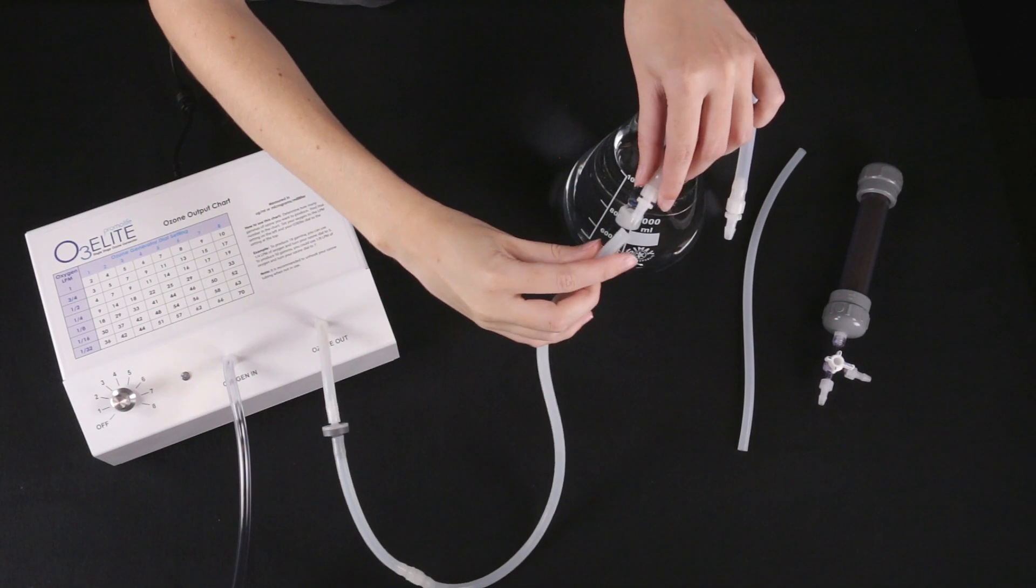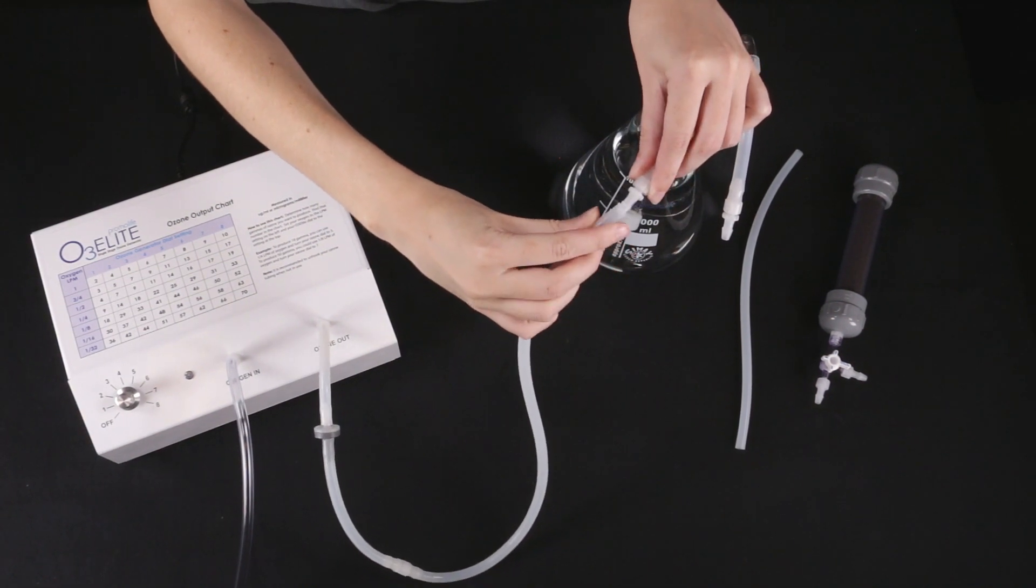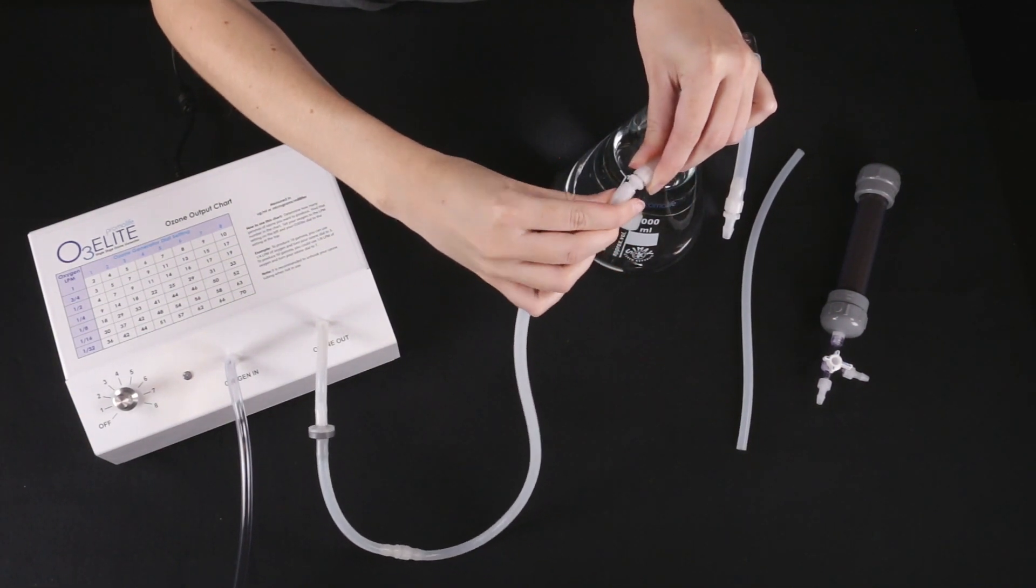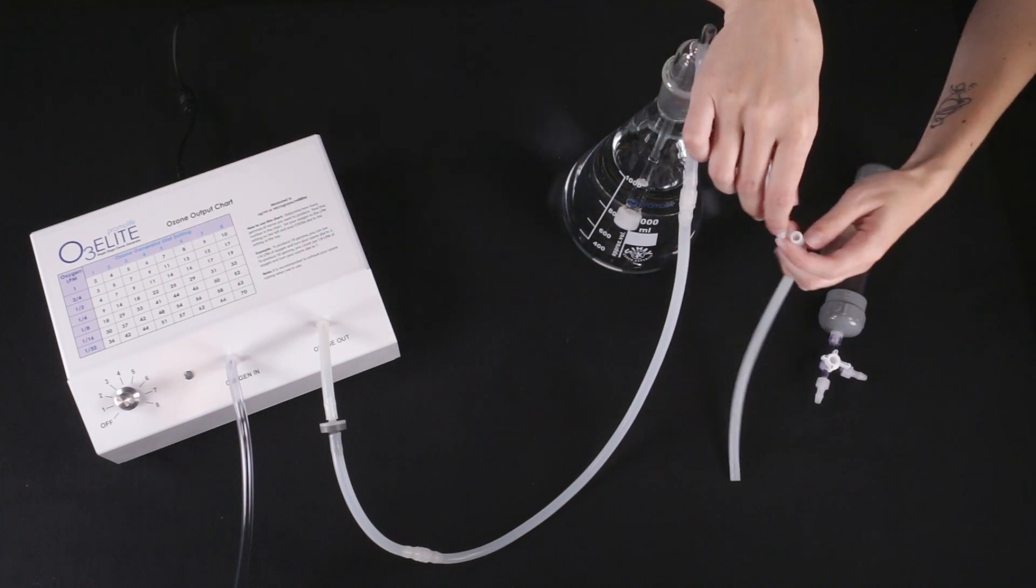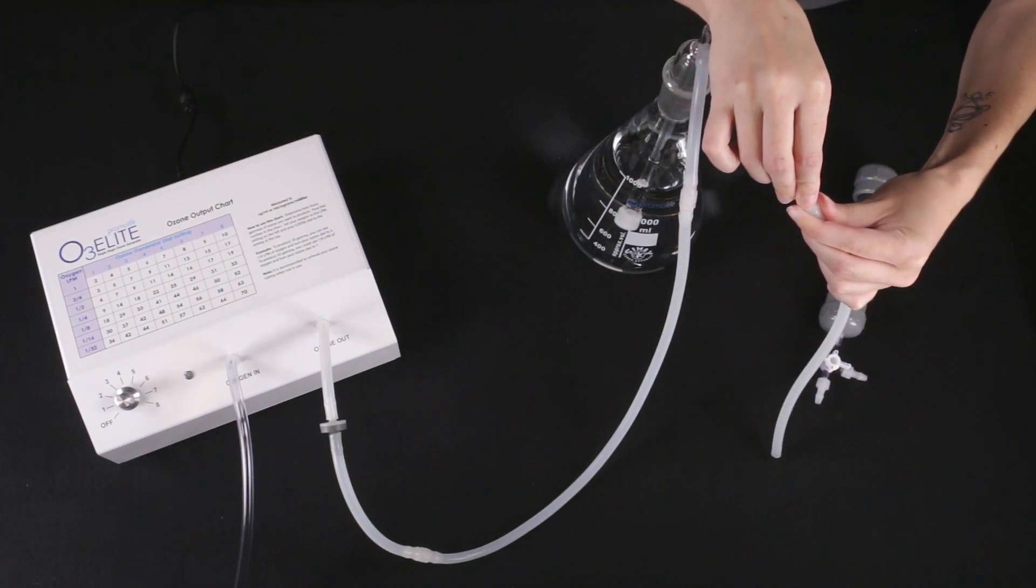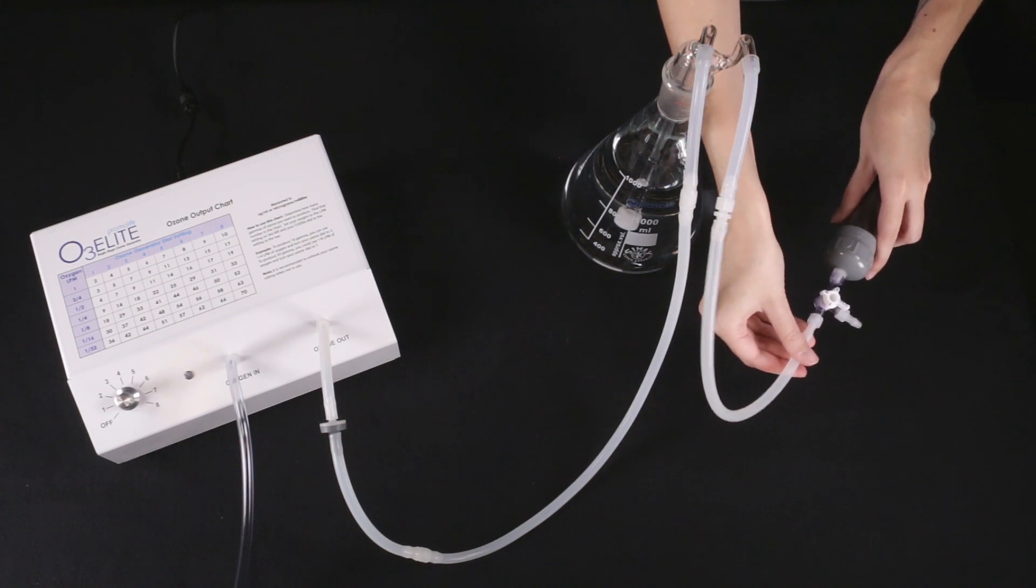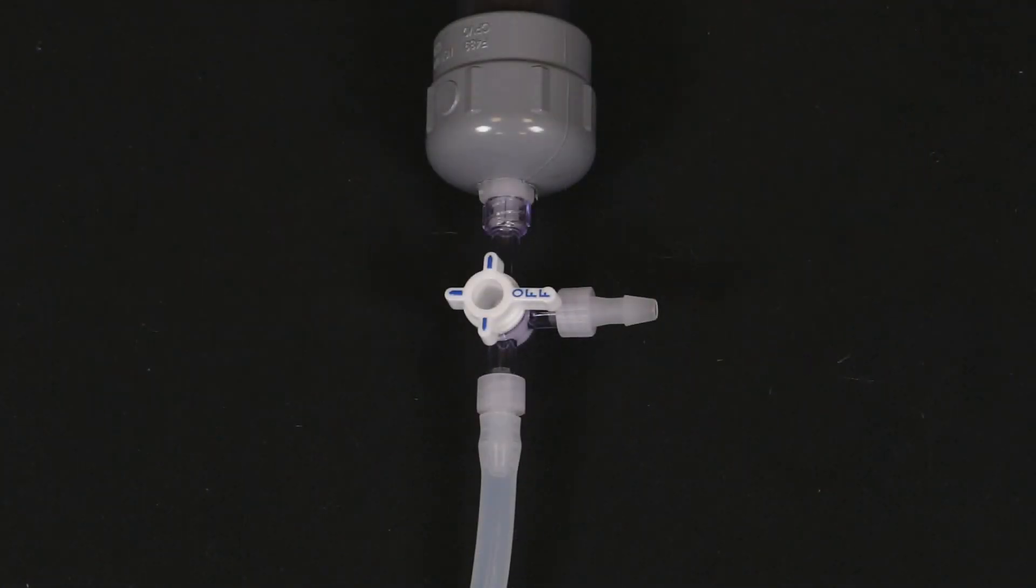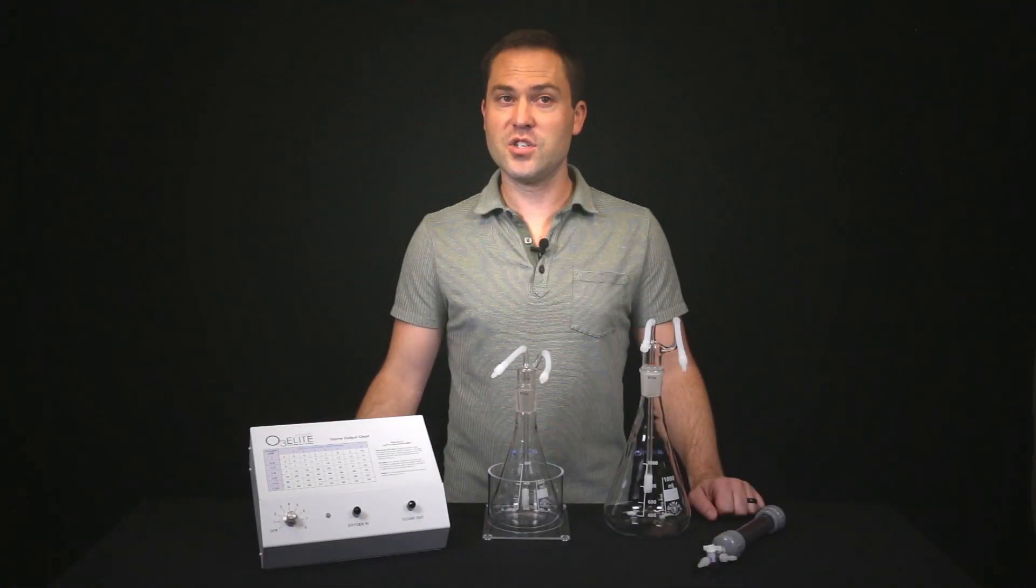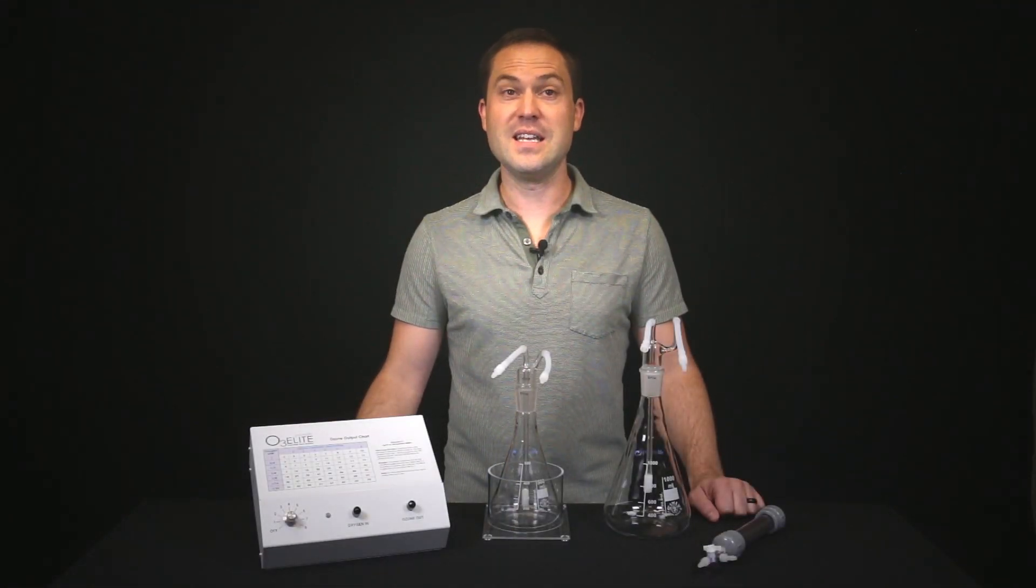You can now connect the other end of the 5 feet of silicone tubing to the ozone-in straw of the bubbler. Then, connect the 3 feet of silicone tubing to the ozone-out straw of the bubbler and the other end of the tubing to the bottom of the ozone destruct system. Make sure that the off valve on the destruct is positioned to the side. This will ensure the ozone is filtered until it is needed for use.